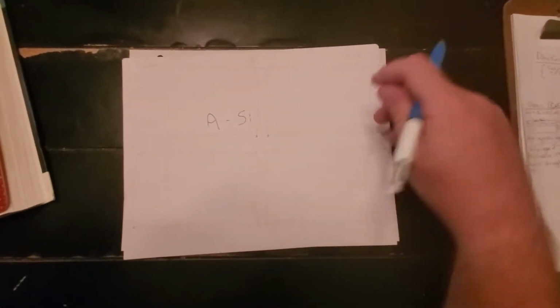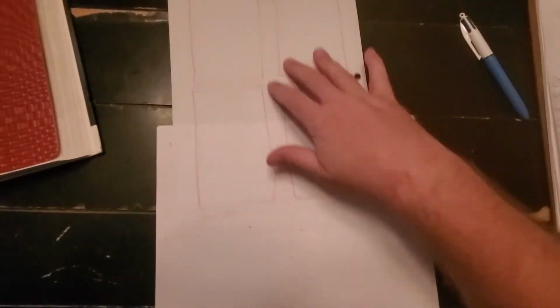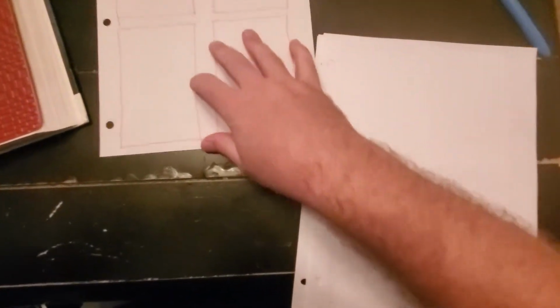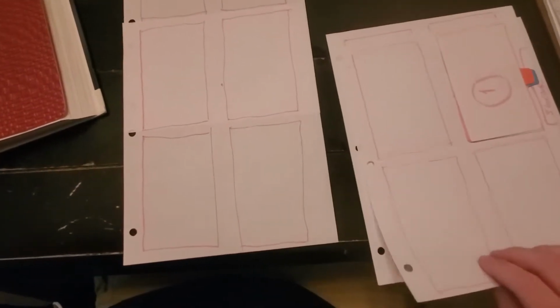Now this layer is going to convert the light photons into an electric charge. Then it goes down into another layer, and to the Del.